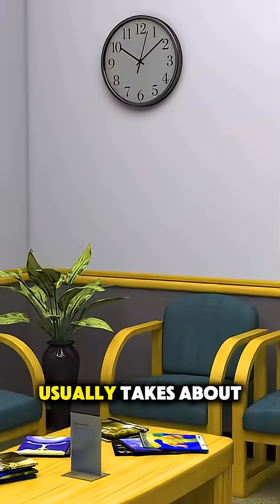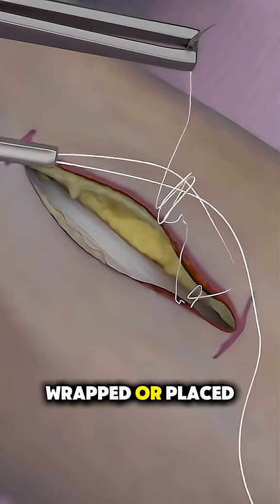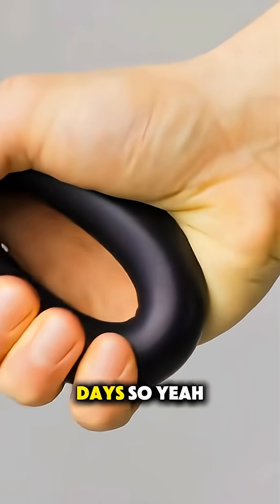The whole procedure usually takes about one to two hours. After surgery, the wrist is wrapped or placed in a splint. Recovery includes physical therapy to regain strength and motion, and most people start moving their fingers and wrist within a few days.